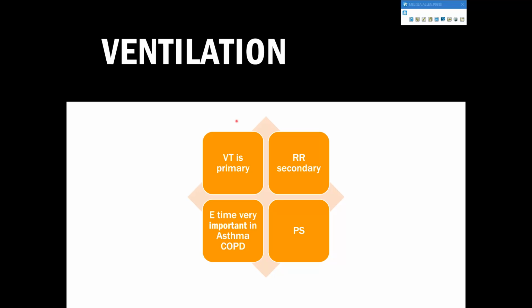Once we're at 8 mLs per kilo, we cannot move it. Sometimes we'll go a little higher, but if you go above 8 mLs per kilo, you're just damaging your lung. You're solving today's problem, which is a number, and you end up creating tomorrow's problem, which is barotrauma and lung disease.